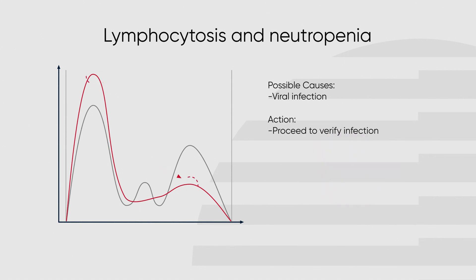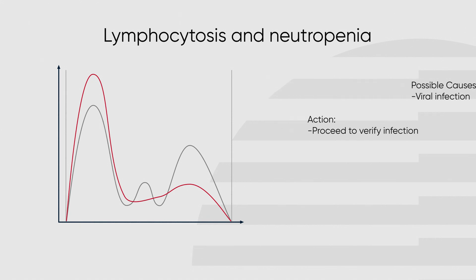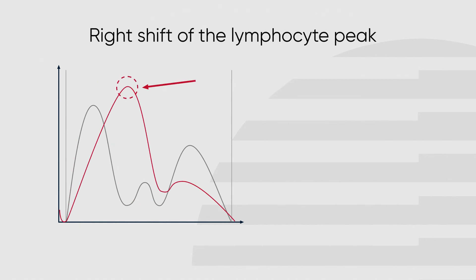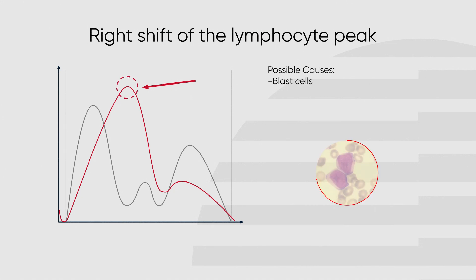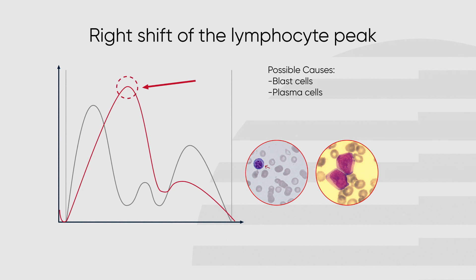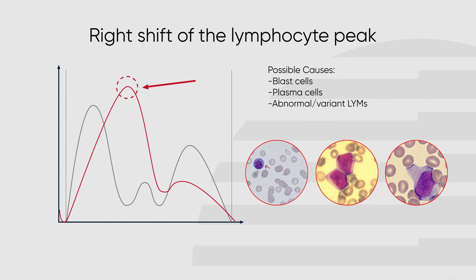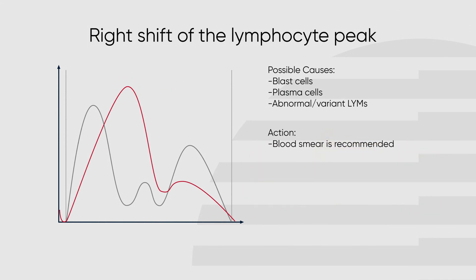A right shift of the lymphocyte peak masking the valley between lymphocytes and mid cells could have several possible causes, such as blast cells, plasma cells, or abnormal/variant lymphocytes. The high increase of mid cells or abnormal cells causes the peaks of the lymphocyte and mid cell populations to merge, and the analyzer is unable to distinguish between them. If this occurs, the instrument may show a DE flag; proceed to confirm the abnormality in smear.